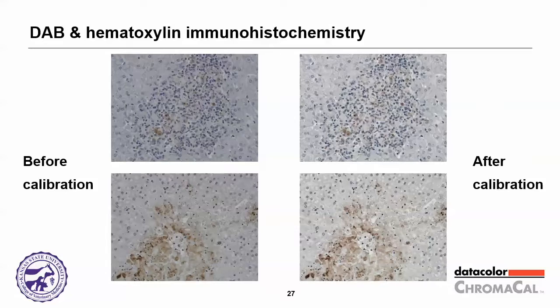And over here, I have the IHC where I can actually see it very well. And once again, these are two different IHC runs. These are IHC runs by hand. So although a technician is following a protocol, there's going to be variations on a given day, environmental variations. What is 5 minutes for one person might be 5.5 minutes for another in terms of the chromogen exposure.